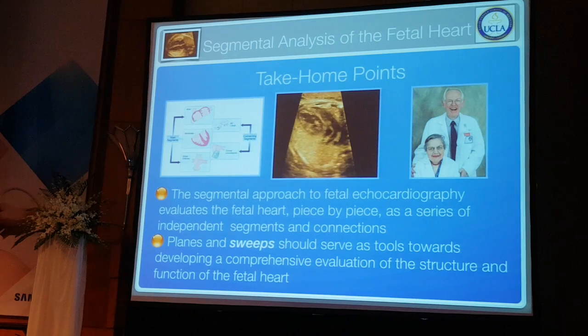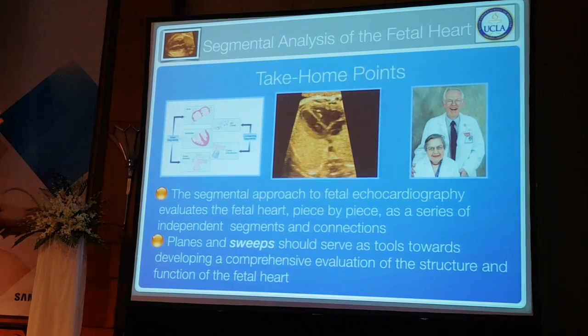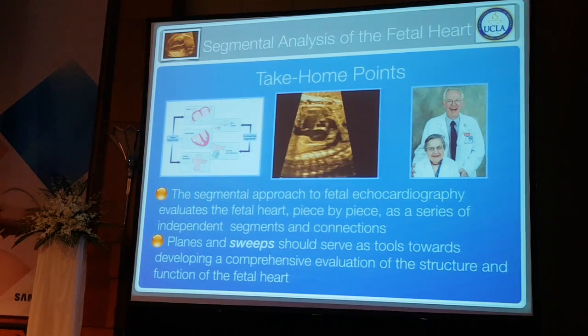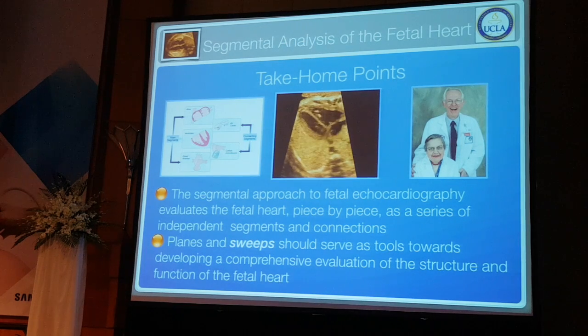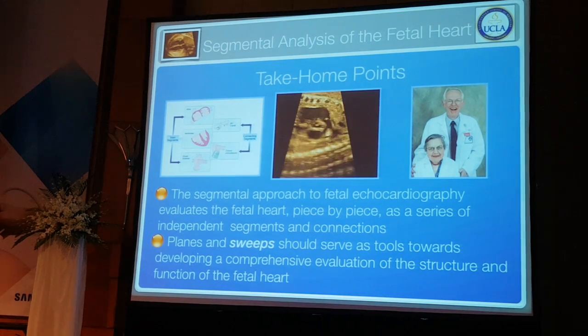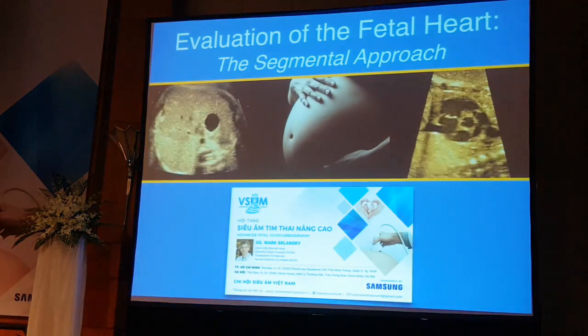So segmental analysis is really an overall view of the cardiac anatomy, going from the veins all the way out to the arteries, thinking in terms of structures and relationships and utilizing views and sweeps just to help you put together in your own mind what this heart looks like, and whether you can tell the patient at the end that this heart, the structures, and the relationships are normal.